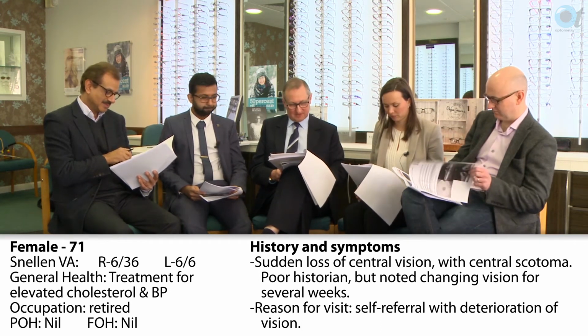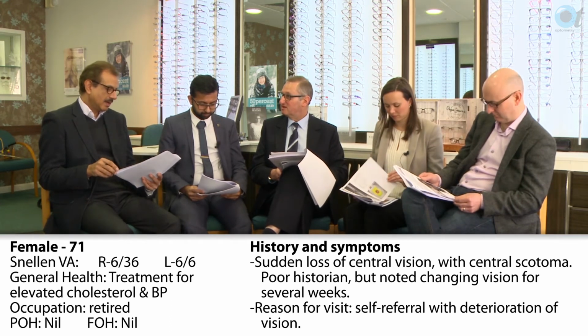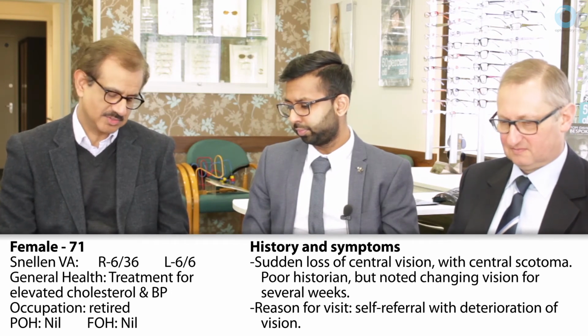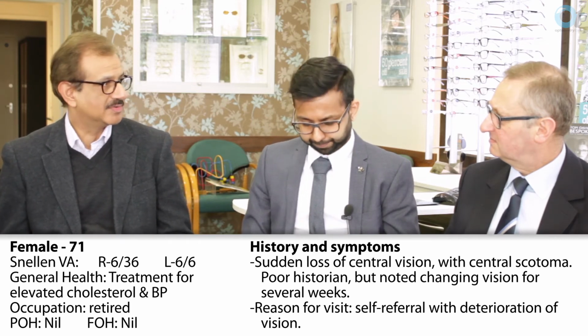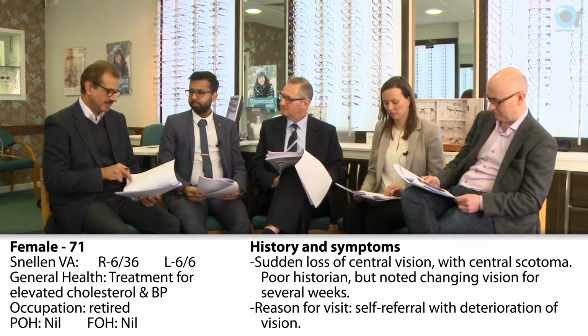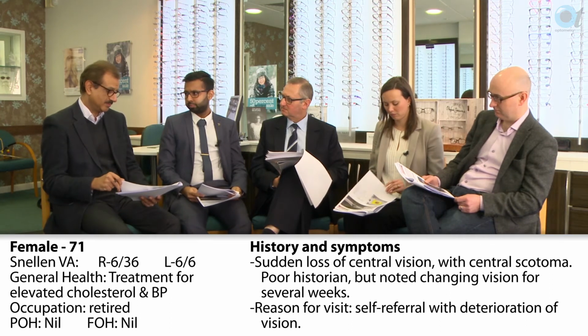Absolutely. So would you have any differential diagnoses, or are you completely clear? If this condition had been there, it says it's sudden loss of vision, so it's obviously not been there very long, but had it been there many, many months, I probably would not gain very much by referring this patient. However, if it's a relatively new macular hole, then she could be available to have some treatment for this. Right.